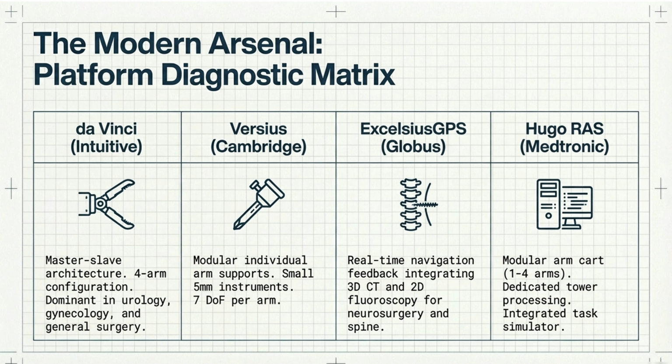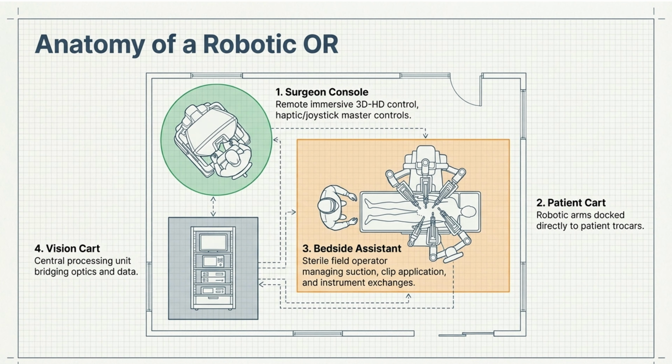You're going to see a lot of these different ones, and you're going to learn how to use different ones. You're going to learn how to drape different ones for all different specialties.